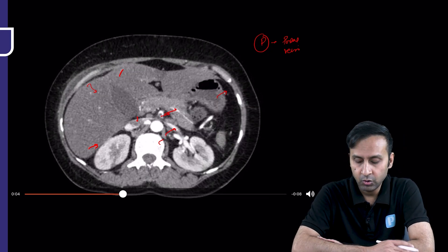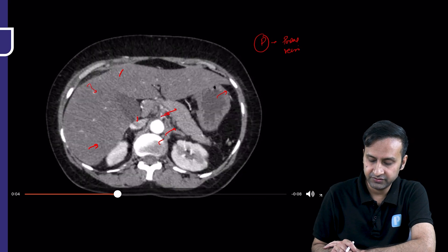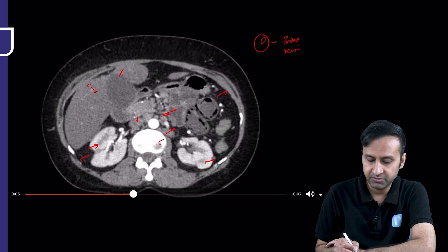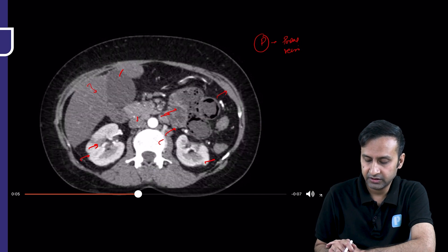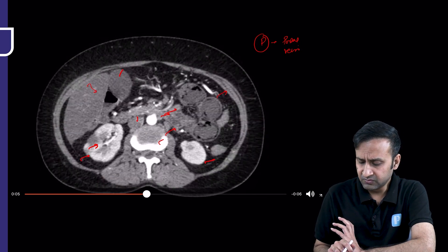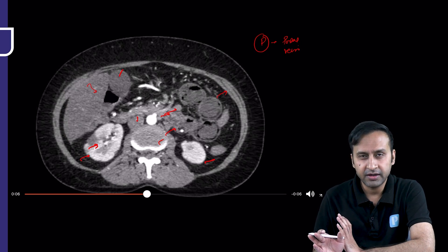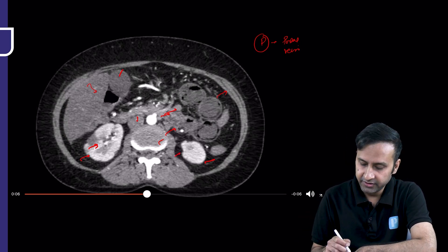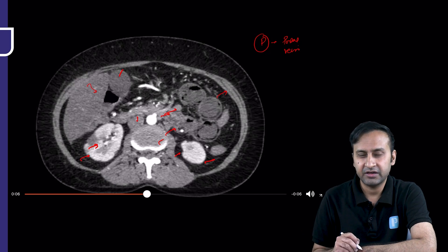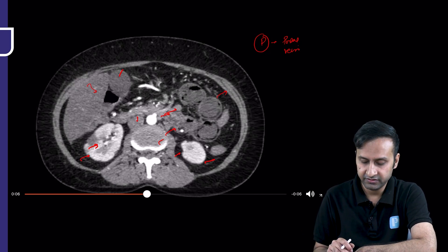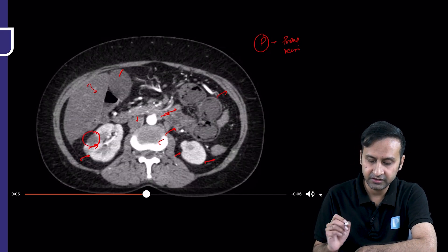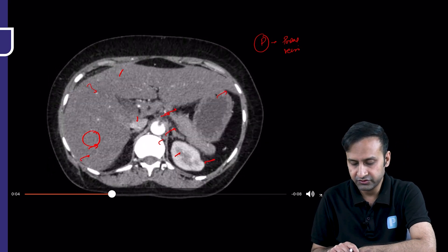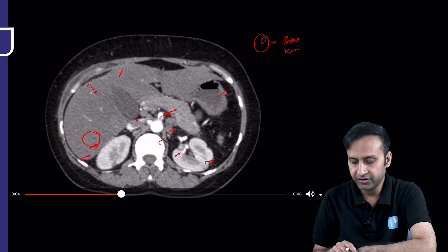One more clue: look at the kidneys — they are showing cortical irregularity suggesting infarcts. We had multiple infarcts in the kidneys as well, indicating multi-system involvement at various stages. Renal scars indicate chronic disease, while the acute renal infarcts visible here indicate an acute pathology. Combined with the emboli in the celiac artery and SMA, we have both chronic and acute disease processes.